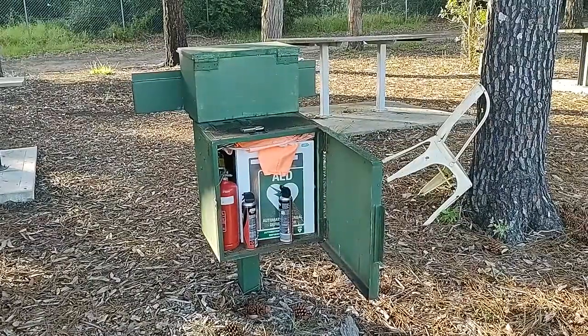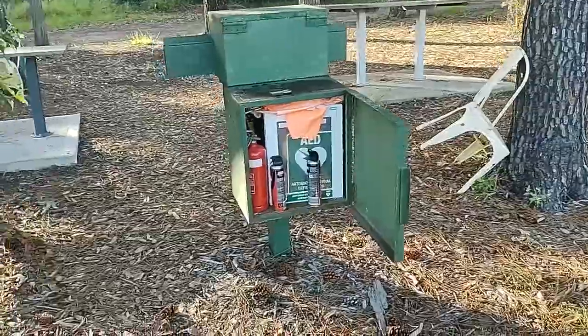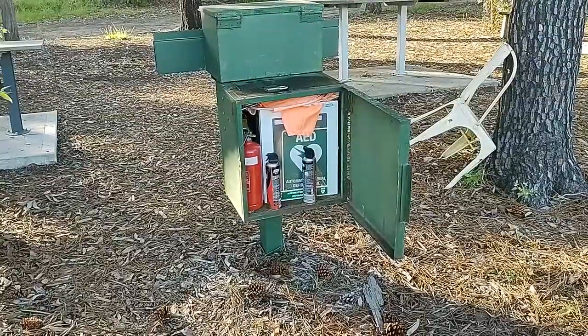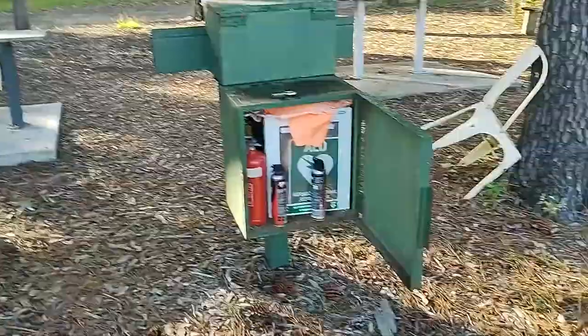I have a friend who's an emergency medical specialist who works at Westmead and Blacktown hospitals. I asked him how long do you have if someone has a heart attack to get the defibrillator on that person and operating. He says you have three minutes. So let's have a look at this defibrillator from the club.